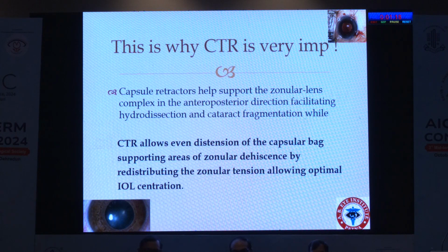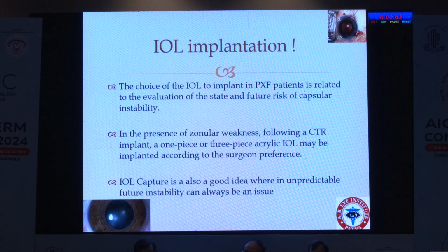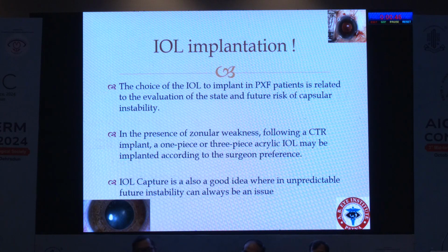allowing optimal IOL centration. Capsular phimosis with IOL decentration and late IOL in-the-bag dislocation are among the most dreaded complications occurring after the surgery, which is why CTR is so important. Capsular shrinking determines centripetal traction on weakened zonules, causing tilt and decentration of the IOL with possible dislocation of the IOL-bag complex. Now, the choice of IOL implantation in pseudoexfoliation patients is related to the evaluation of the state and the future risk of capsular instability.